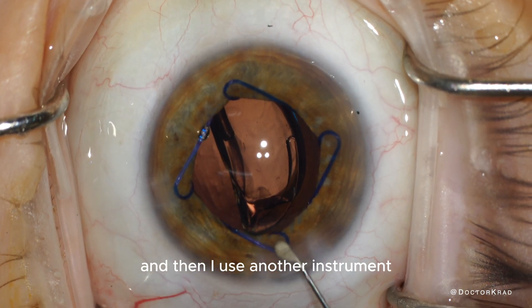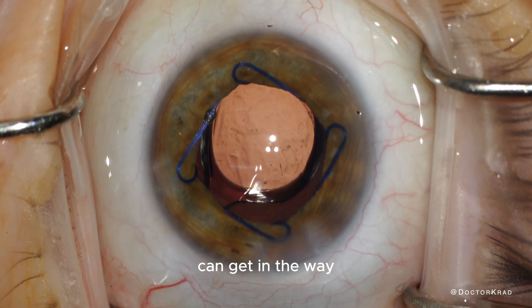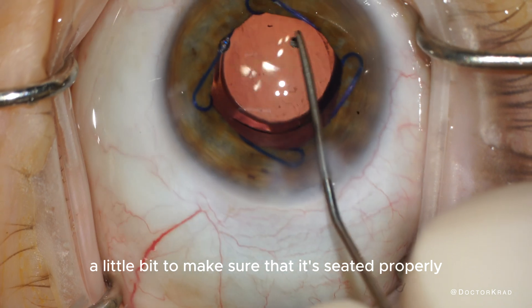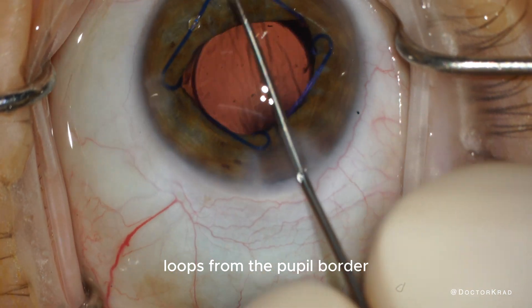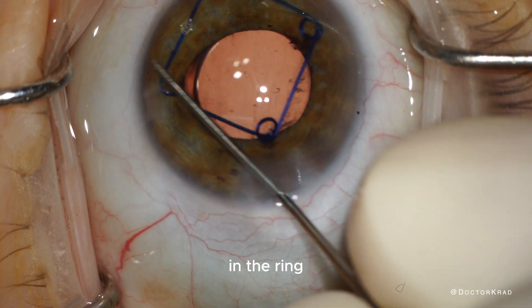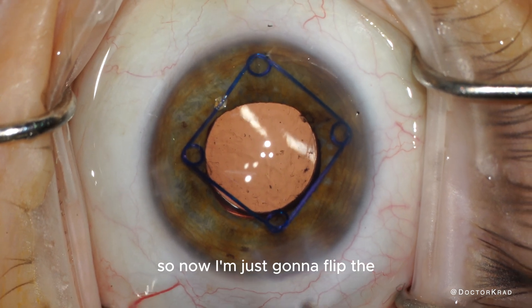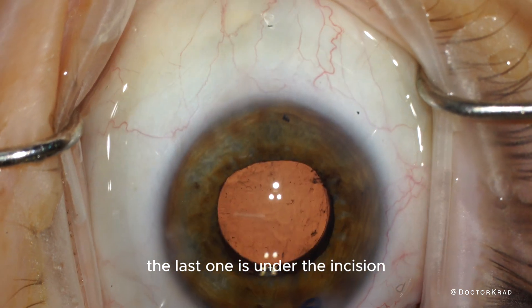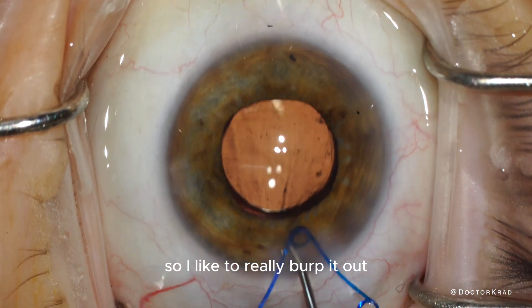The lens implant starts to unfold and I use another instrument to position it inside the capsular bag. In a very shallow eye with a shallow anterior chamber, the Malyugin ring can get in the way, but as long as you use enough viscoelastic and keep reinflating, it's usually not a problem. I'm dialing the lens to make sure it's seated properly. Now I'm going to remove the Malyugin ring — I disengage the loops from the pupil border carefully to make sure no iris tissue is trapped in the ring, as that would cause trauma to the pupil. All loops are disengaged.